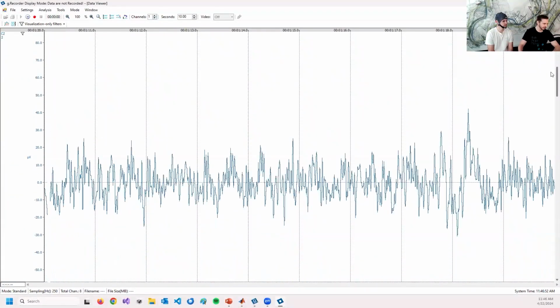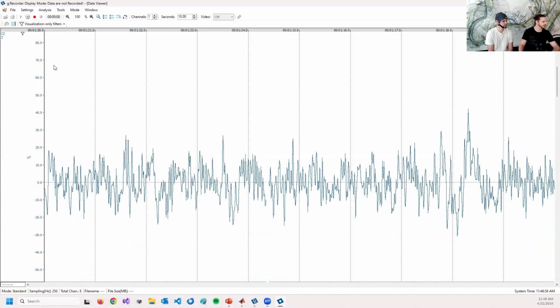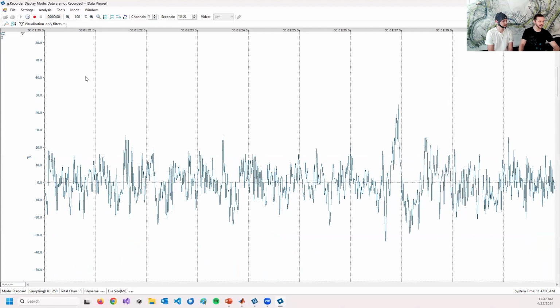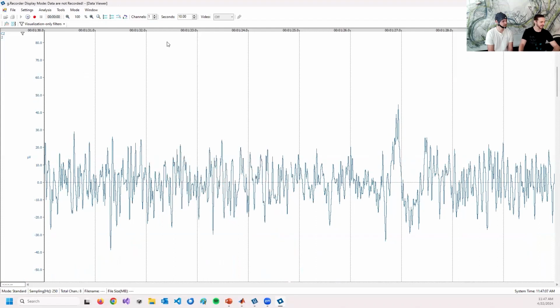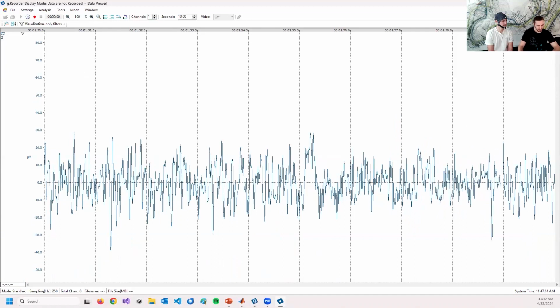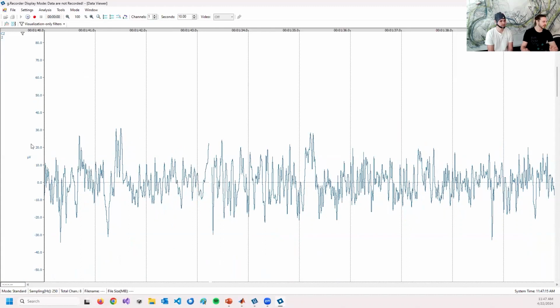So this is the channel we applied filters to. It's within plus minus 100 microvolts, and that's good EEG. So if you can close your eyes again, Michael, you should see some alpha waves again. And open it again. Yes.